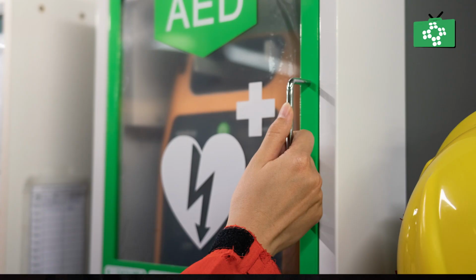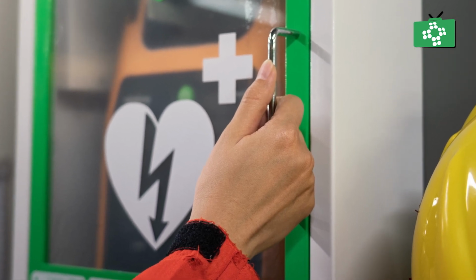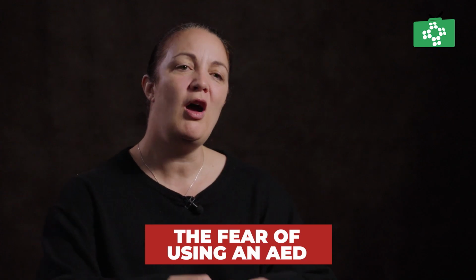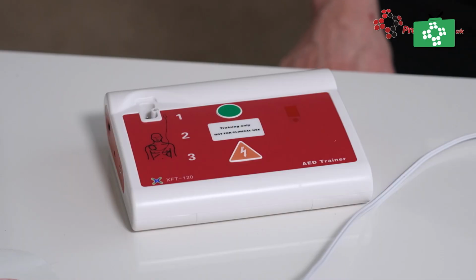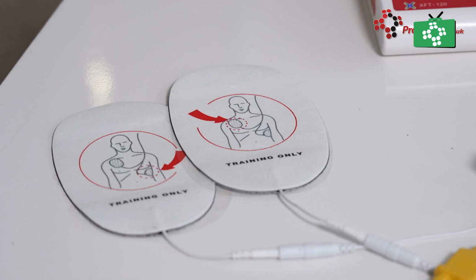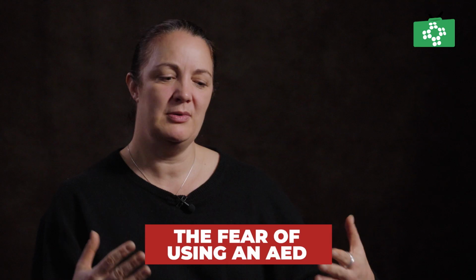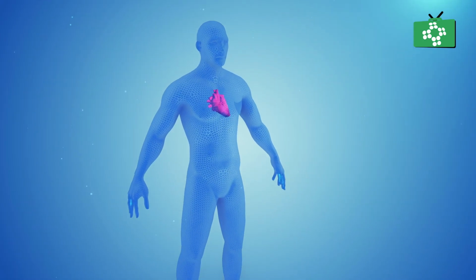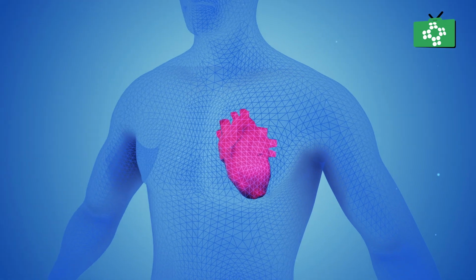I do often hear people, when I'm chatting to them, that are concerned or worried that they might use an AED incorrectly. These machines, these pieces of kit are very simple and very straightforward, and you literally have to open up the box and it will start talking to you in a really simple way what to do, and it just does step 1, step 2, step 3. In the kit you will have pads, and on the pads it shows you a nice clear picture of where to put them. You basically are thinking about the principle, if the heart sits in the centre of your chest, slightly to the left, you are putting the pads and applying it to the skin to ensure that the electricity will conduct through the heart when you're shocking.